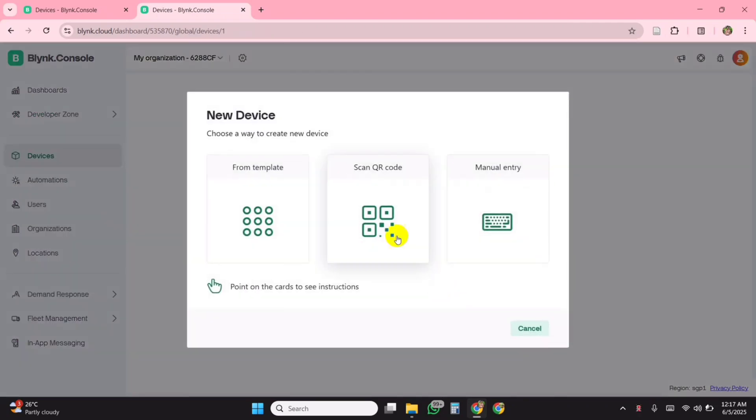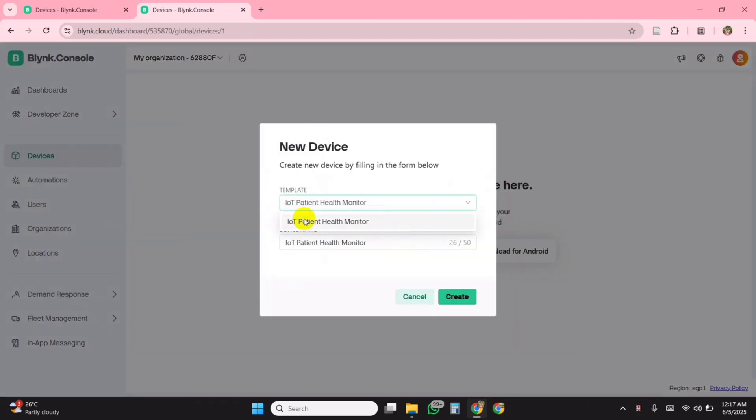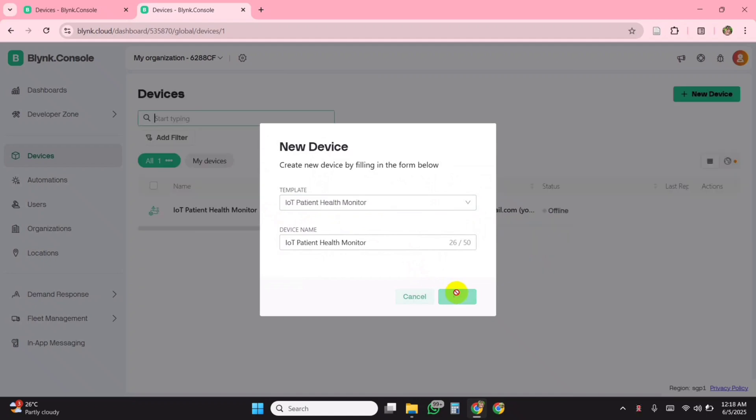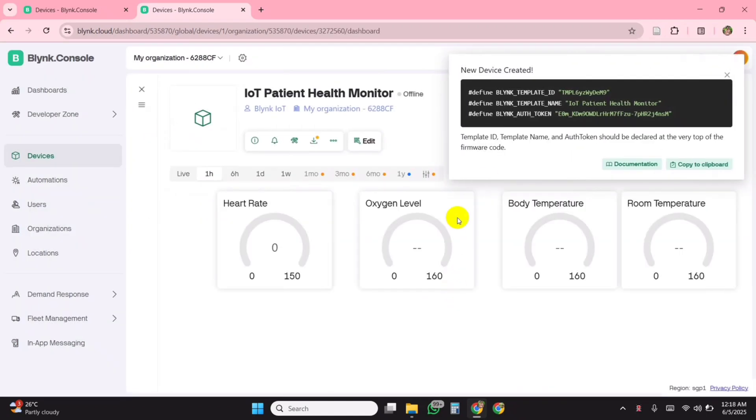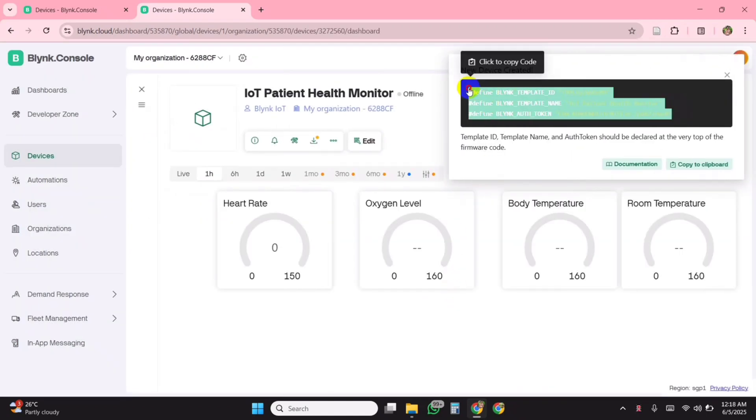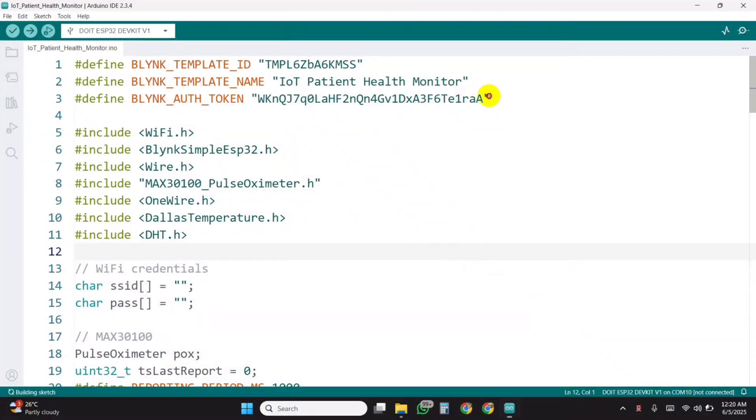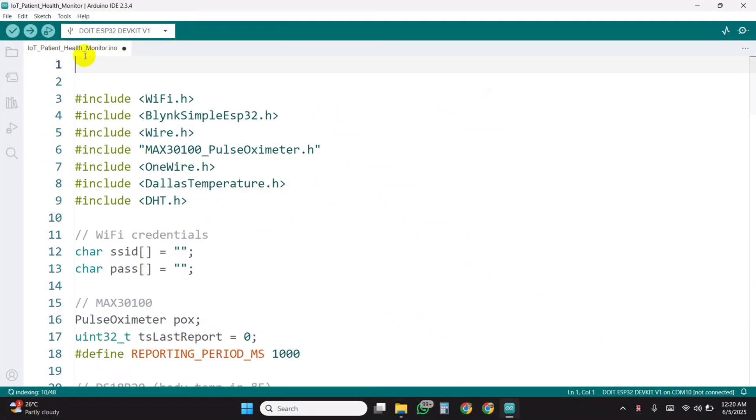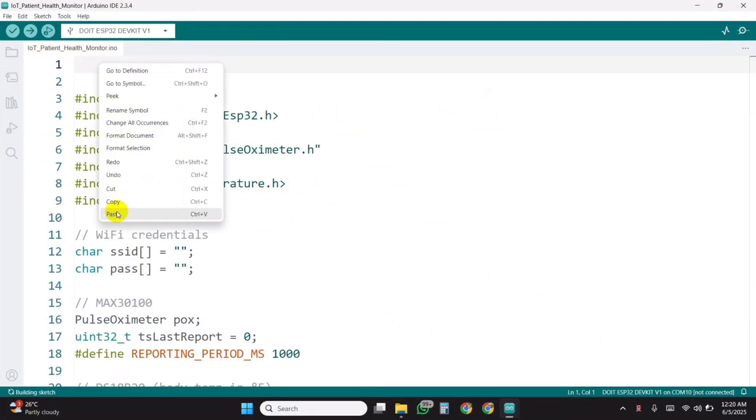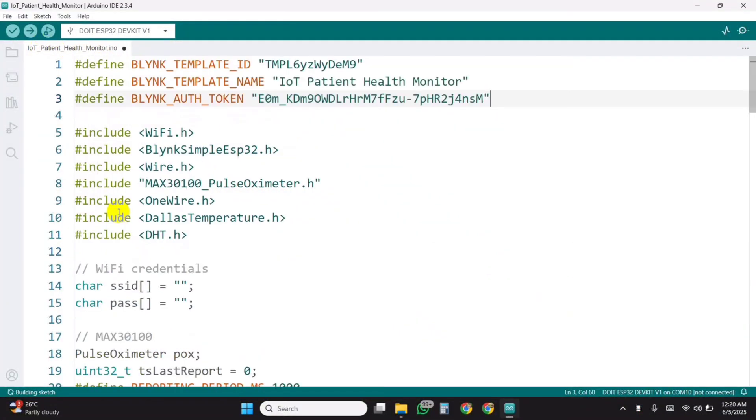After the dashboard is ready, create a device using the template. Once done, you will receive the Blink template ID, device name, and authentication token. These details need to be entered at the beginning of your Arduino code.